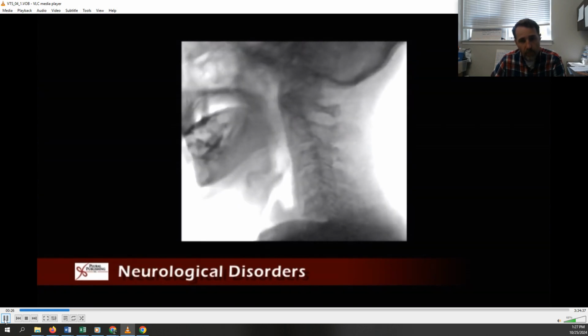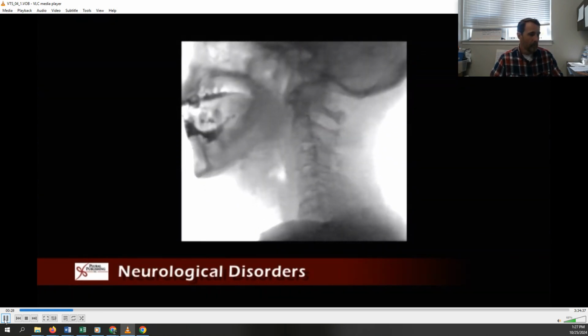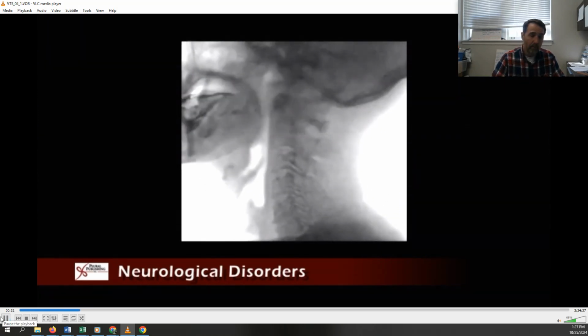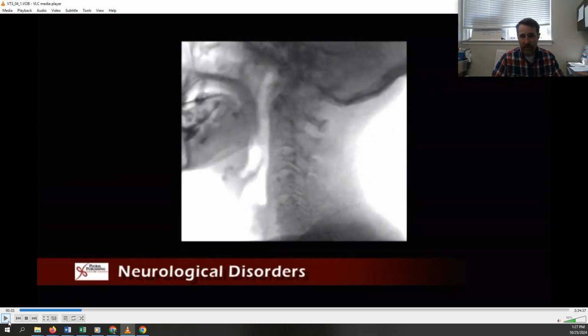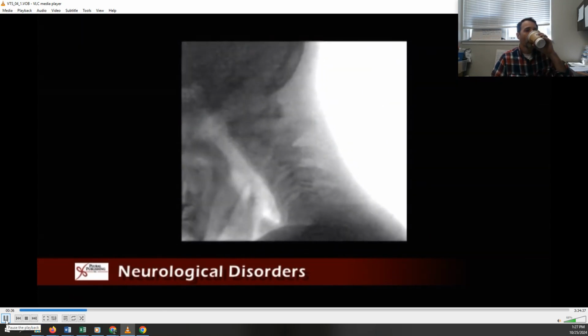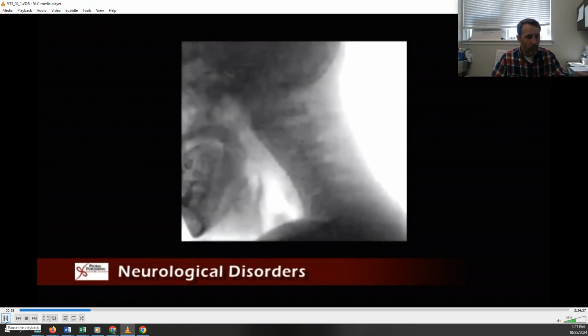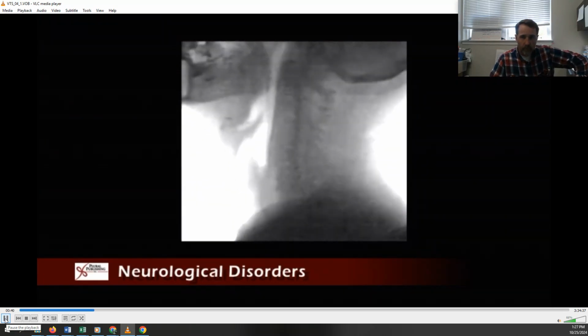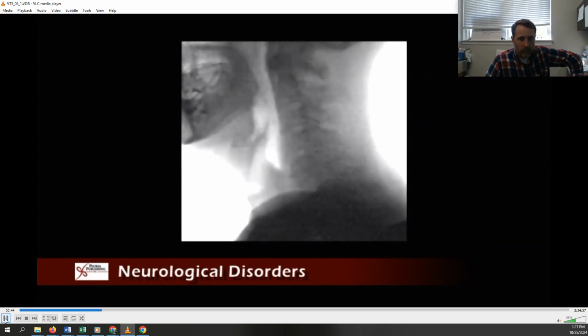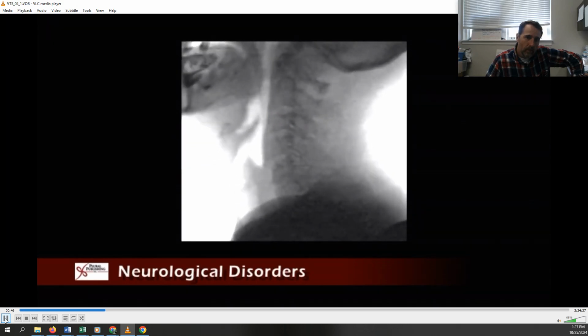He agreed to hospital admission for PEG tube insertion, while his respiratory status remains adequate. A PEG tube is a feeding tube. A video fluoroscopy is completed once the tube has been inserted to determine if there is any food or drink consistency he can continue to take in small amounts for quality of life purposes.